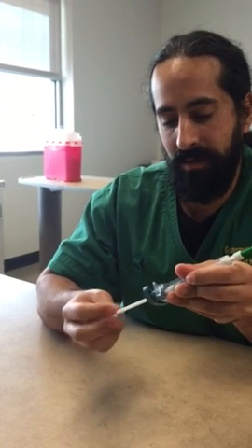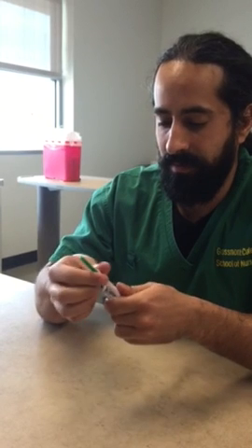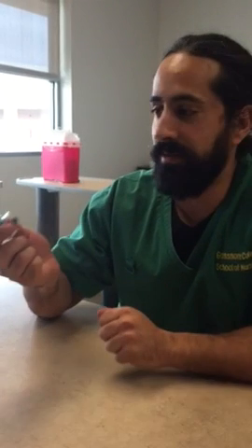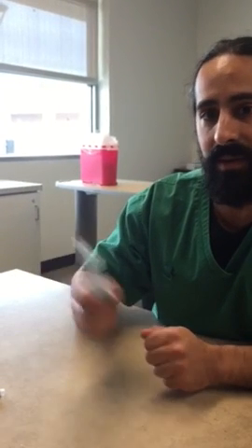We're going to turn this and thread out the plunger. We're going to dispose of the vial in the correct receptacle, and we can save the CarpyJet — we can rinse it with water or use an alcohol swab around it and use it again.